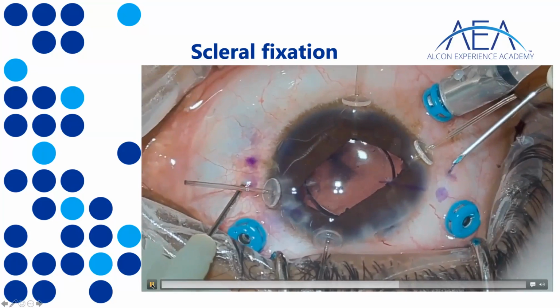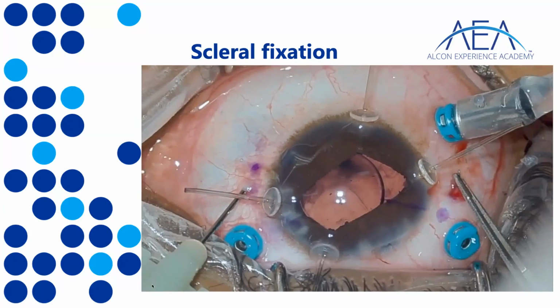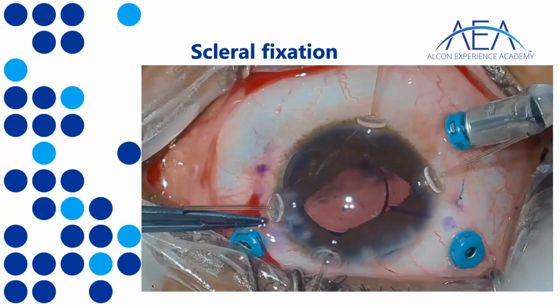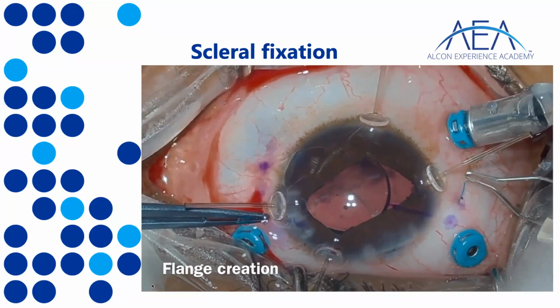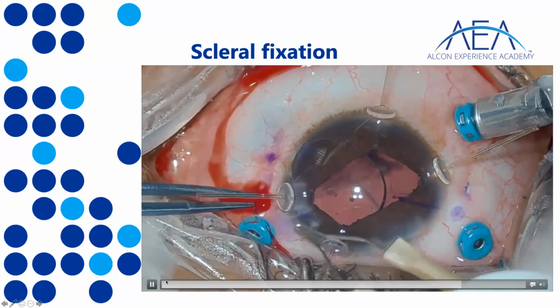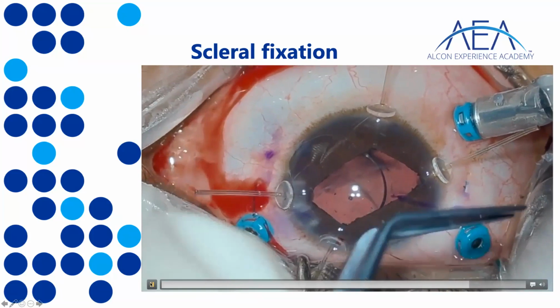At this stage, you remove the needle, you grab the haptic, and you create the flange with a cautery. And this creates sort of a small button at the end of the haptic, which is here, as you can see, and here.